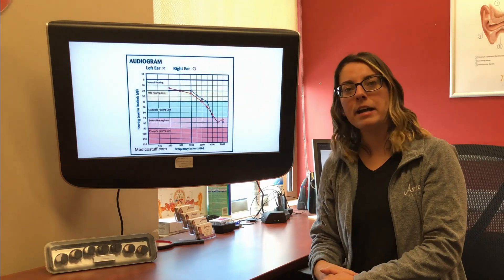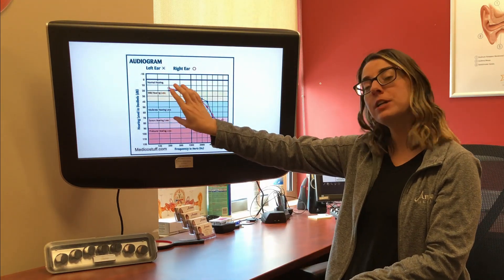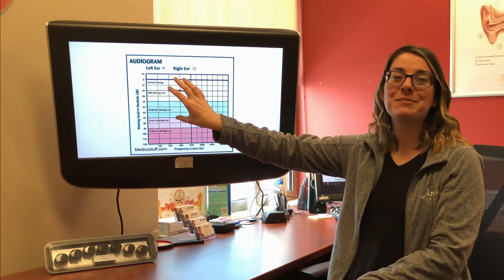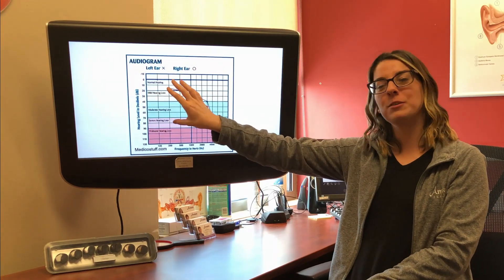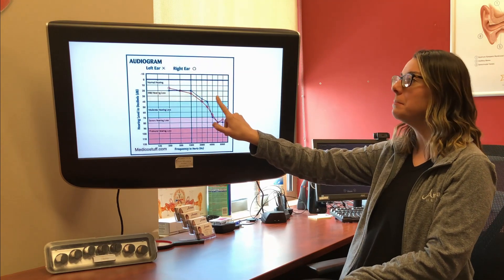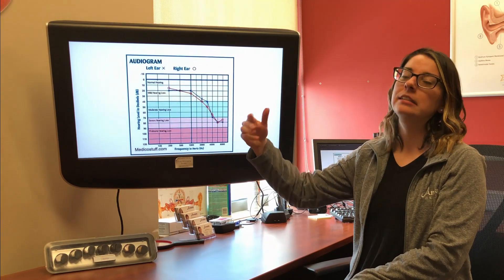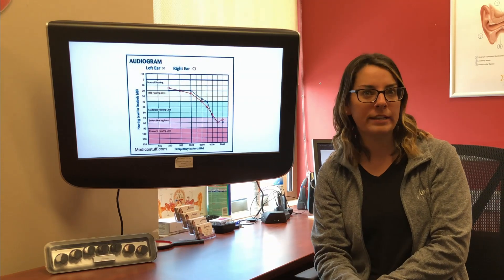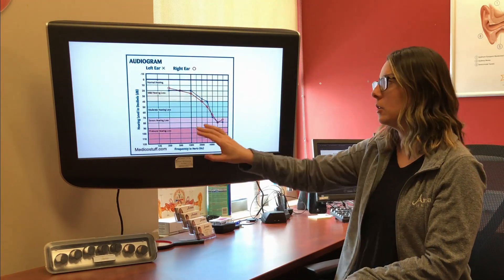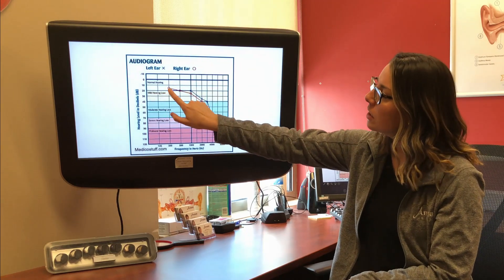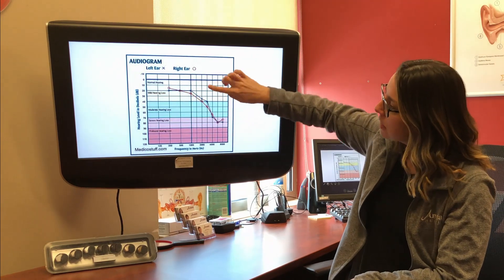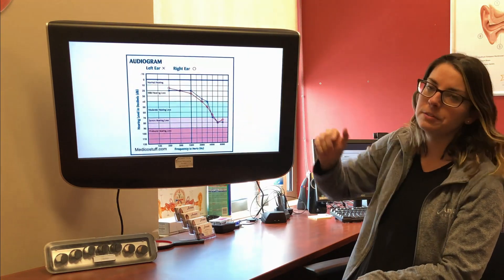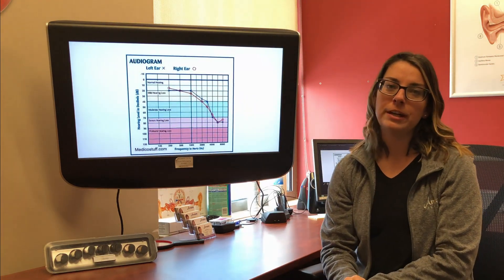The reason that happens is that these low frequencies, where hearing is pretty good, are responsible for the power of speech — those vowels. Now when we get up to these mid and higher frequencies, that's where all the clarity is, and that leads to all of those misunderstandings that might be happening. So again, very common — starting off normal in the lows and dropping to mild, moderate, and all the way down to severe in those very high frequencies.